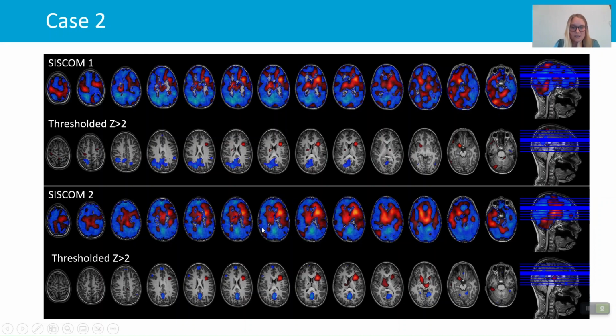In the second scan, we actually see also a big hyperintense blob of hyperperfusion around the focal cortical dysplasia, but we see a more extensive propagation pattern, also because this seizure had a longer duration and was accompanied with more symptoms, a more intense semiology.